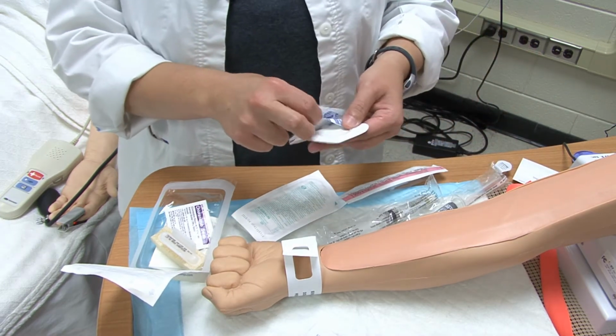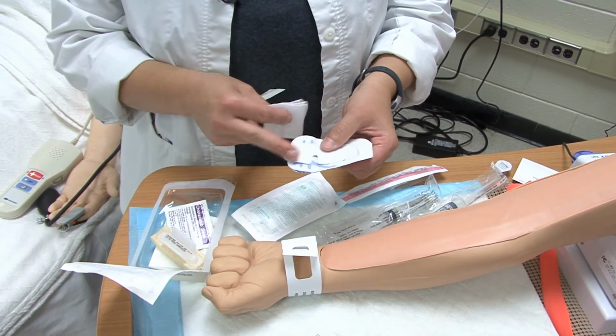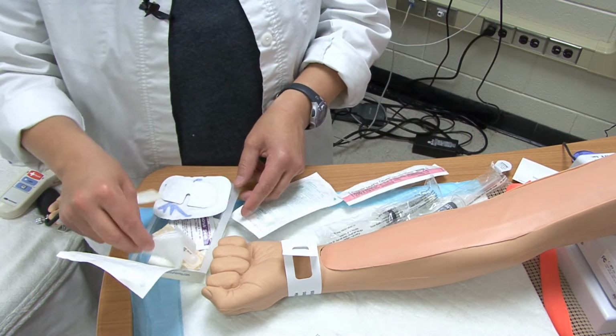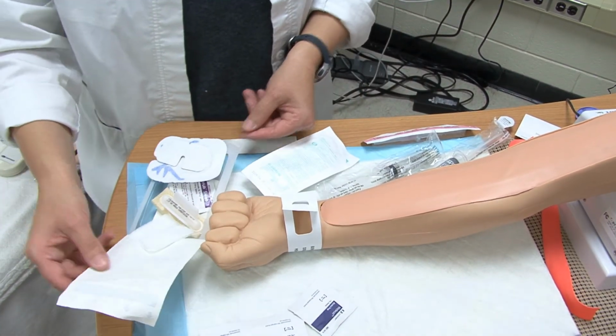Some of the other things that may be in there would certainly be one of the securement devices. Some of your initiation kits will have Tegaderms or something else in them. They may have the gauze in there to catch the blood, and then they've got some extra tape or something like that. So I've got my pieces here in my initiation kit.